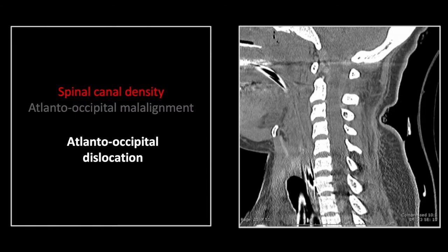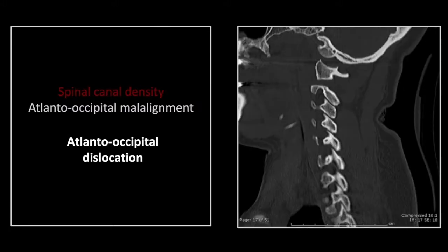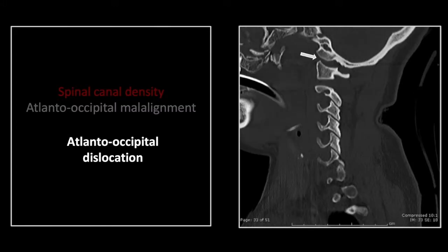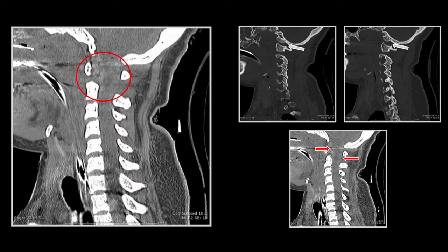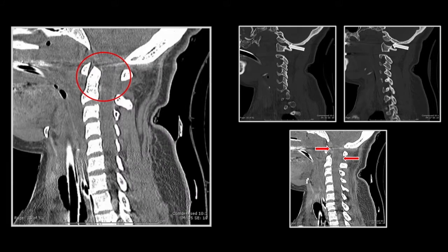This is nearly always a fatal injury, and it is nearly always associated with epidural hemorrhage in the superior cervical region. Here you see that epidural canal density anteriorly and posteriorly. It is critical to use the orthogonal views to detect this particular disruption — the malalignment of the condyle and of the C1 lateral masses on one side and on the opposite side. Obviously, the condyles are unseated and distracted.